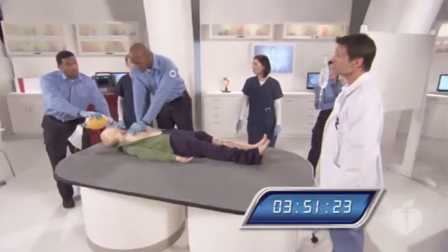Sam, are you getting good chest rise? Yes, and I'm being careful not to deliver ventilations too quickly or forcefully. Okay, great. Let's continue there.